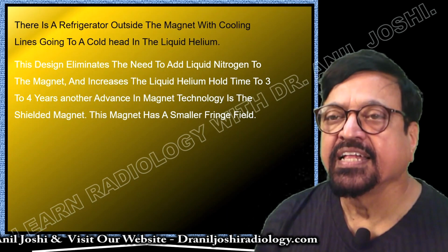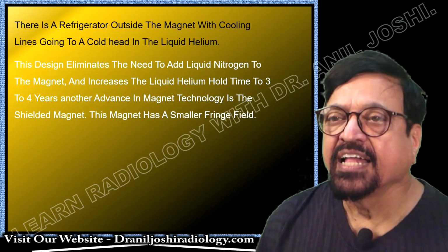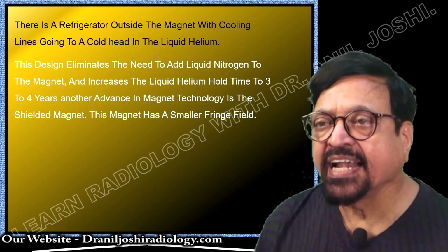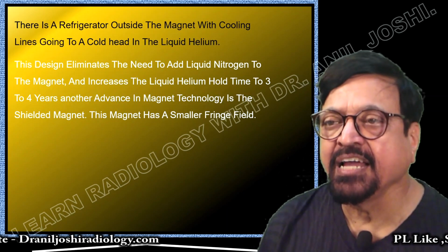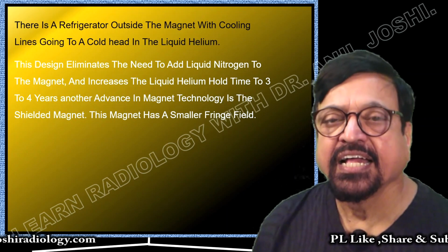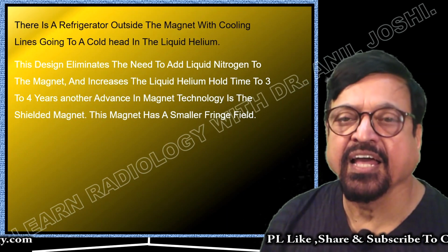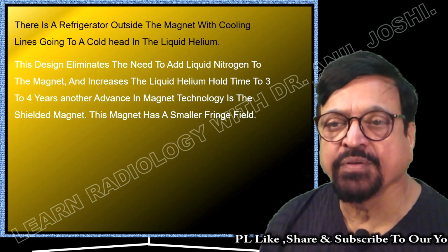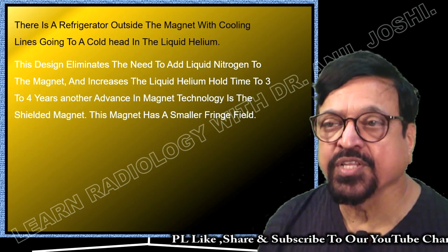Now with this design, that is the refrigerator outside, there is no need to add liquid nitrogen to the magnet, and it increases the liquid helium hold time to 3 to 4 years. In earlier days, in the experimental stage, it was almost every third to fourth day, then it was postponed, and now it is up to 3 to 4 years.